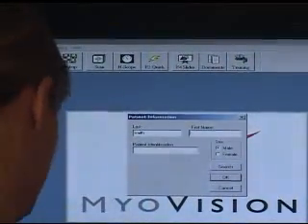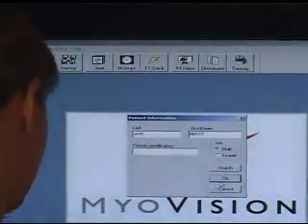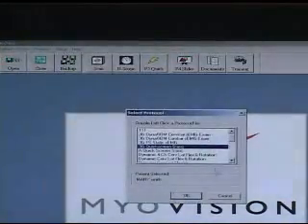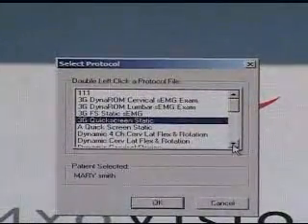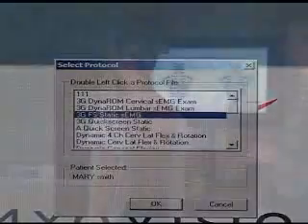You go to the software, click scan, put the name in, and select the test, cervical test. At this point, the cervical dynamic test is one complete test with all ranges of motion. You go from screen to screen to screen.